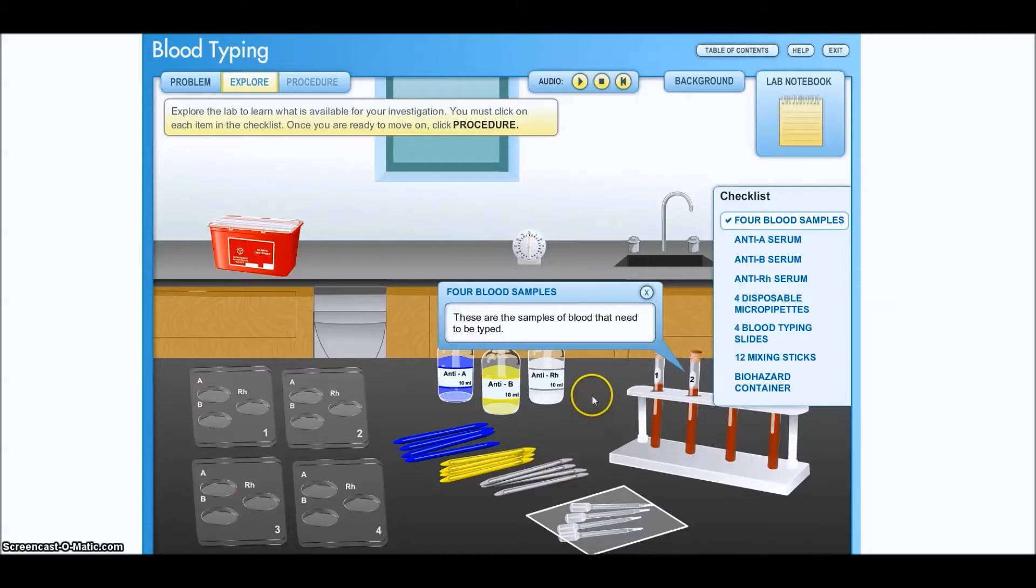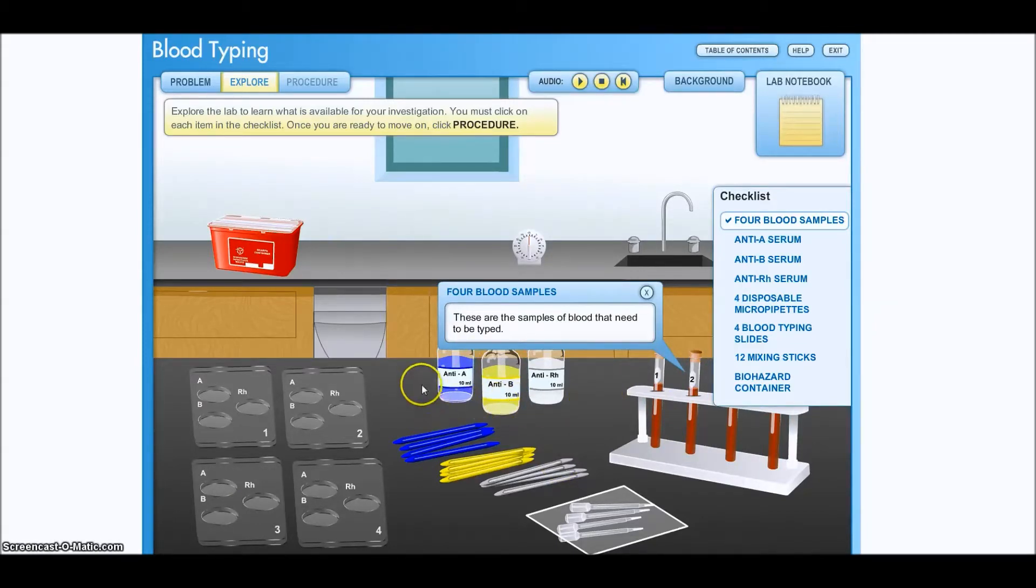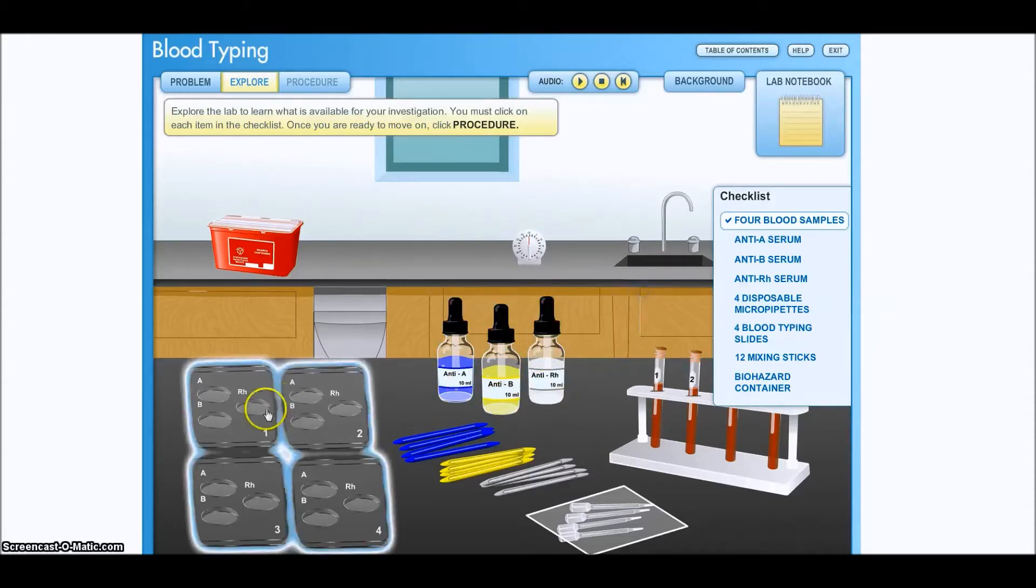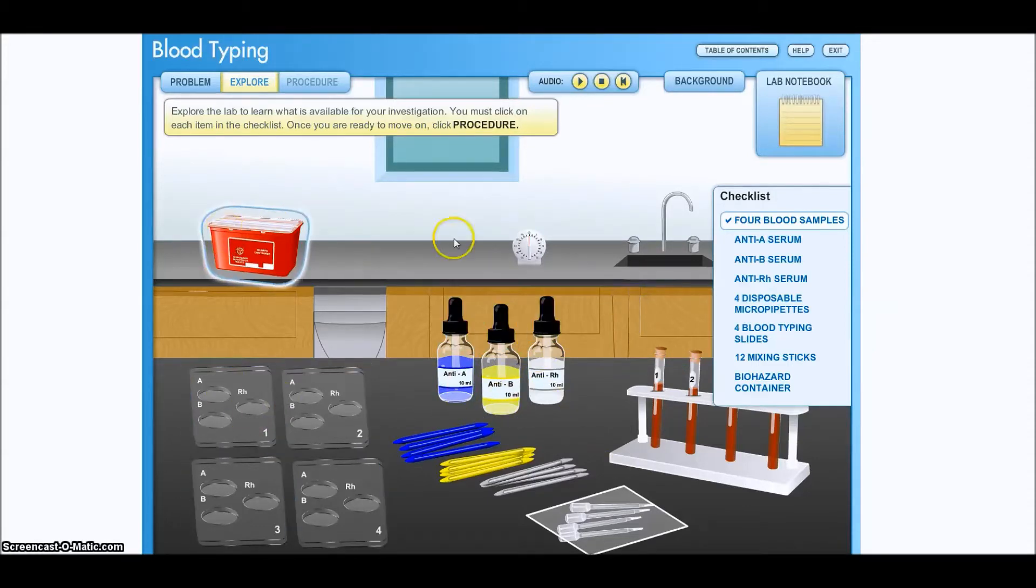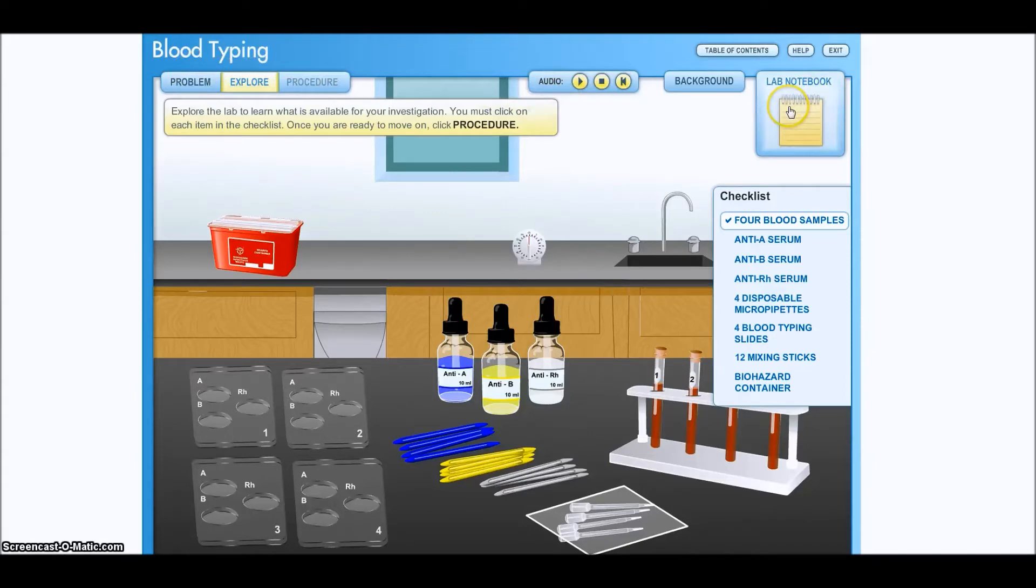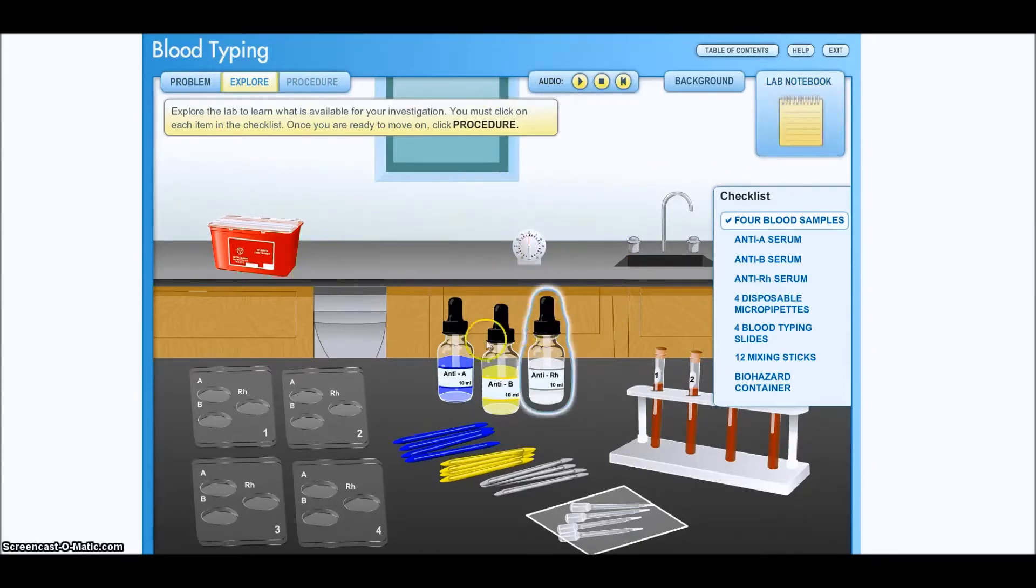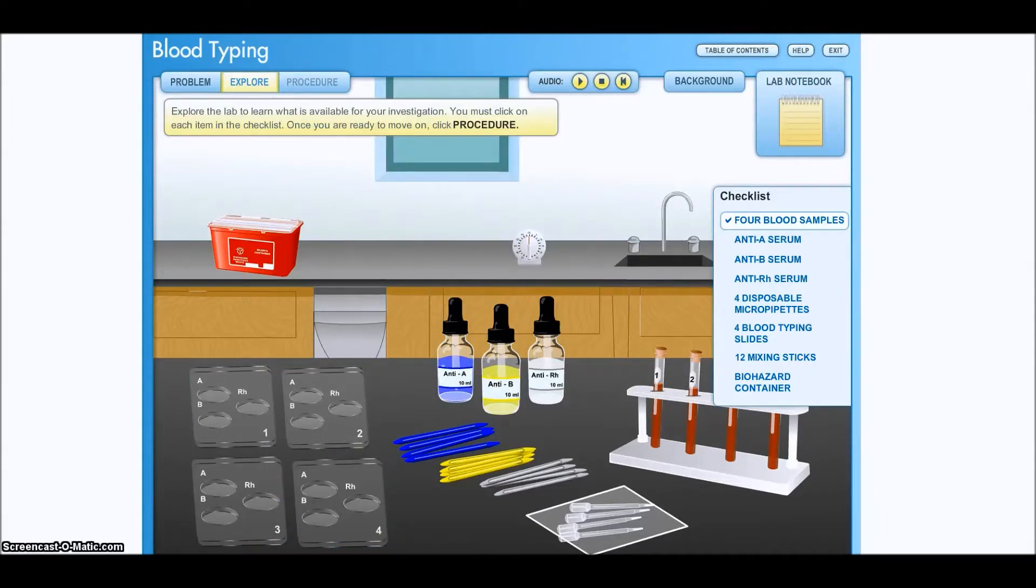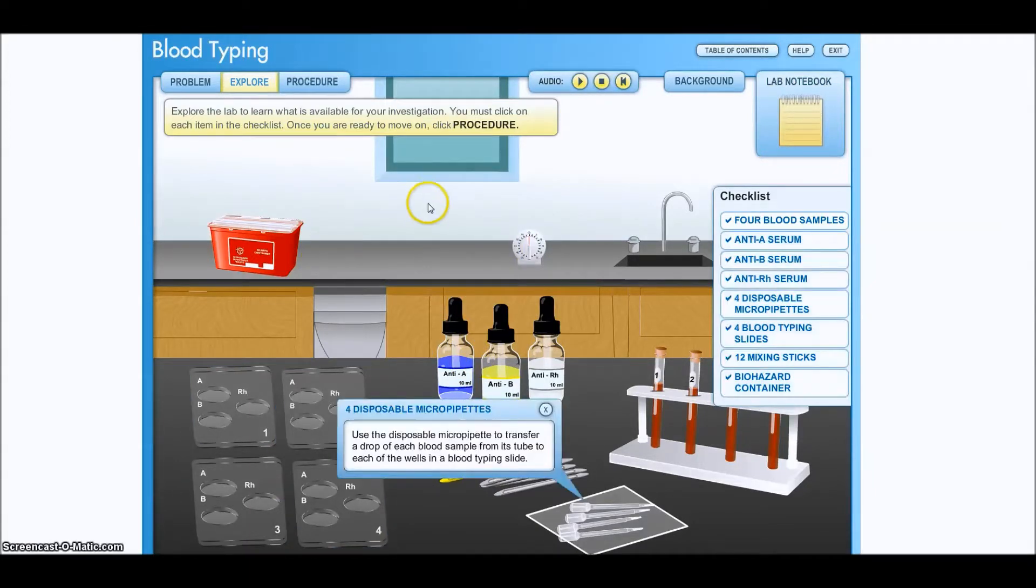I'm going to pause this and move on so that we shorten the length of this video. But when you go to this, you should go through and click on every item in this lab and then follow the instructions because you'll have to go and fill out the lab notebook to guesstimate what the blood type is before you can go on. Now we're going to go on to procedure.